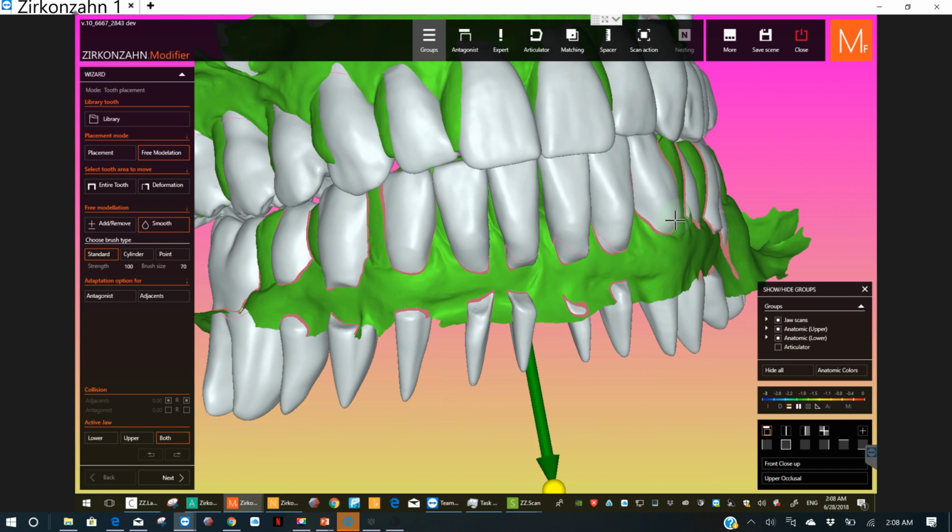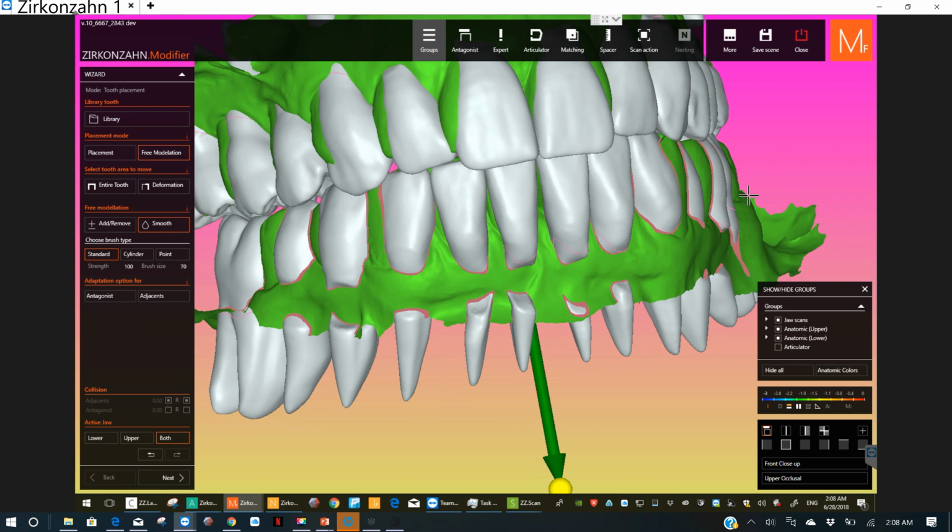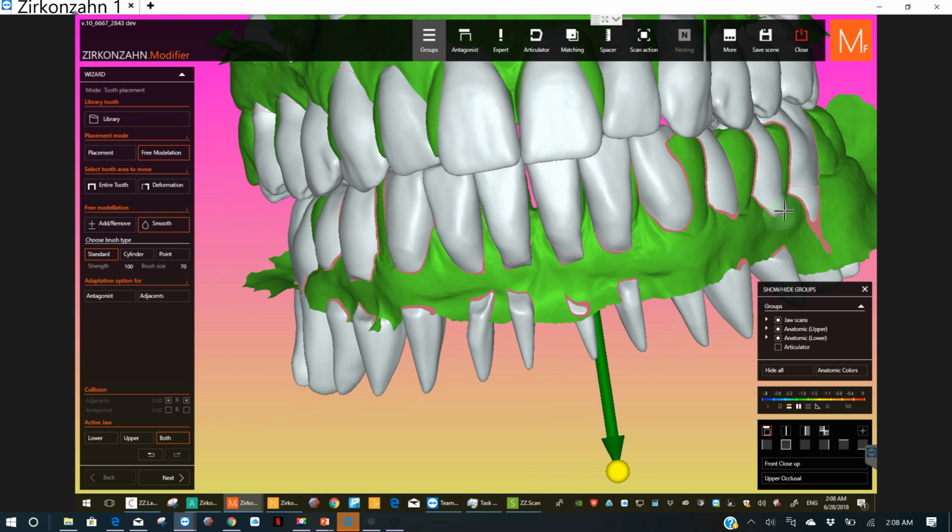So we're following our neuromuscular rules. We're doing a try-in before we do the surgery. It's going to be pretty awesome. And the only 3 times we've done it, it's some of the best smiles we've done all year.